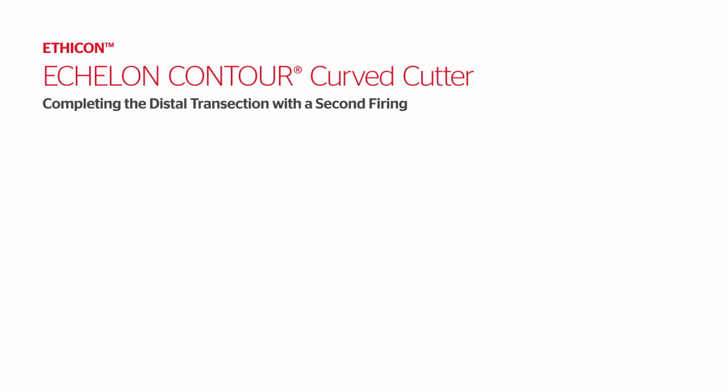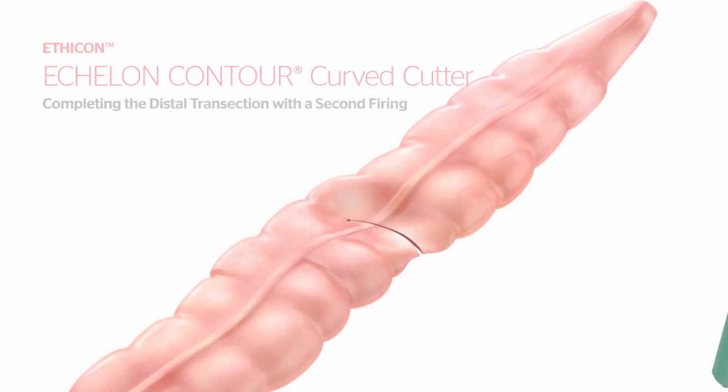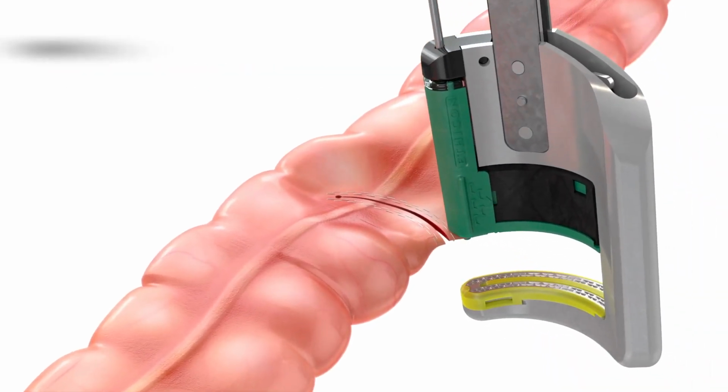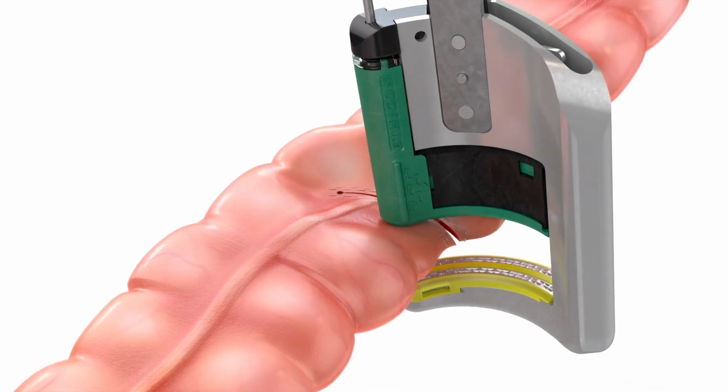Completing the distal transection with a second firing. When positioning the contour for the second firing, you may choose to position the second staple line where the first line ended, or, if appropriate, you may choose to offset the second staple line to control the location of the staple line crossing.